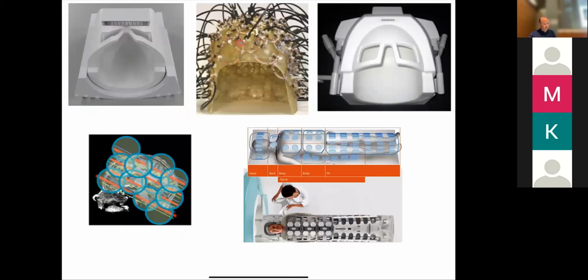Okay, so just to remind you, this is all enabled by the fact that modern scanners have multiple channels and multiple coils. And so we're going to talk a little bit about how you design those coils, like what's the optimal way to design those coils, okay? And on your next pre-lecture quiz, which will be posted today, there'll be some questions where you have to think about which coils have the best performance, okay?